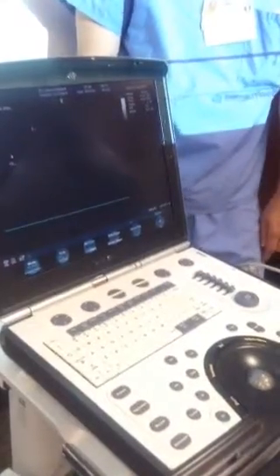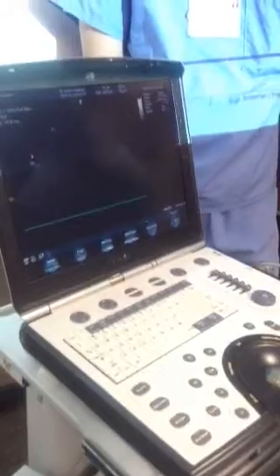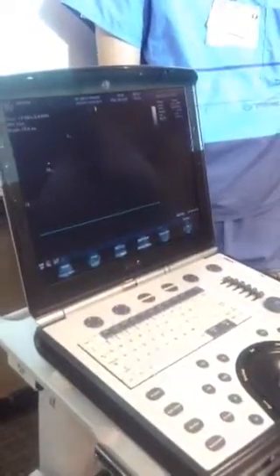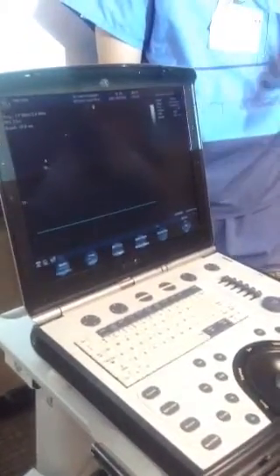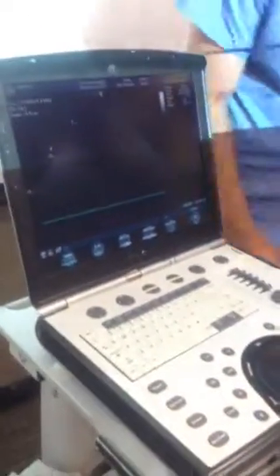Okay. Scan the patient. You're not going to get too far without gel on board. Believe me, I've gone up to the floor more times than I can tell you without gel, because somebody takes them off for some reason. So make sure you have gel and EKG leads with you. It makes your life easier.